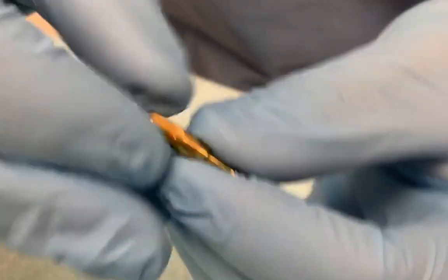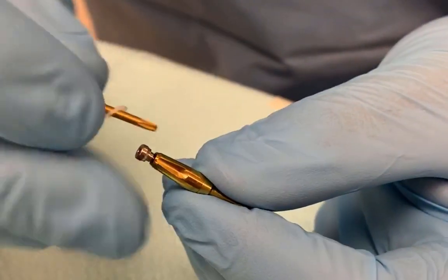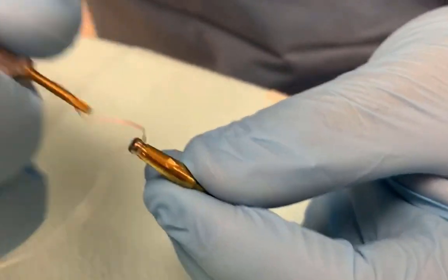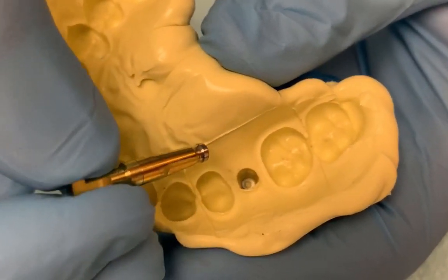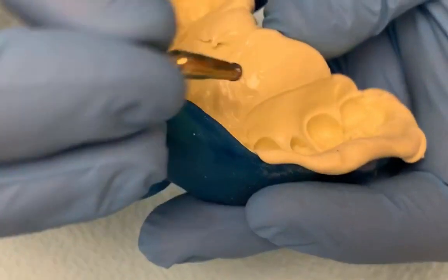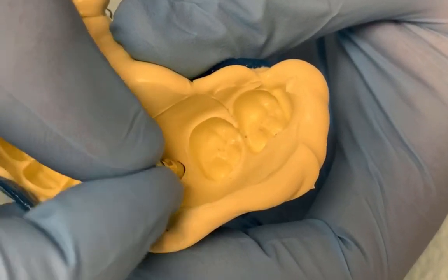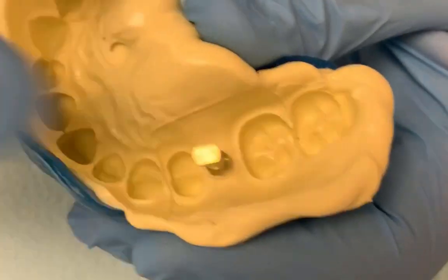Make sure it lines up. Get it really tight with the driver. And then place this back into the impression. You want to make sure to line up the ridges with the area in the impression, and then it should go all the way in.